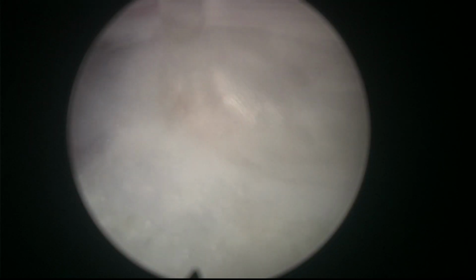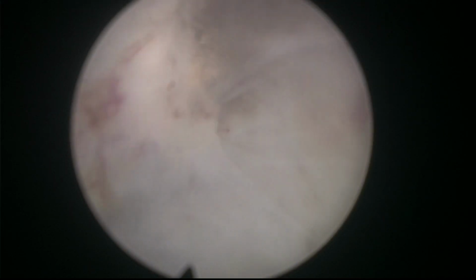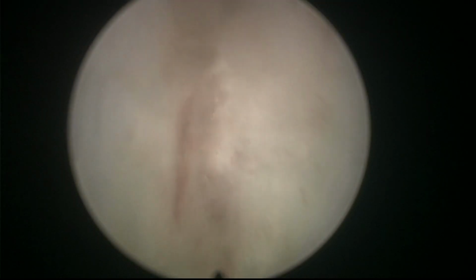The penetration of the energy in the tissue is quite shallow. It's not deep at all. So just enough to coagulate. And here we are coming towards the side. Let's see if we can release the side. It's a matter of going around the adenoma. Of course, these very large prostates don't leave you a lot of space, so you have to learn to navigate around the adenoma to find your position. But usually, even in very large glands, you can find your way. Here it looks like we are following the right direction, reaching the bladder neck area.